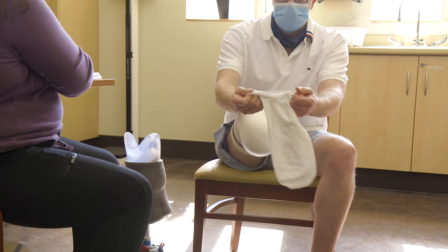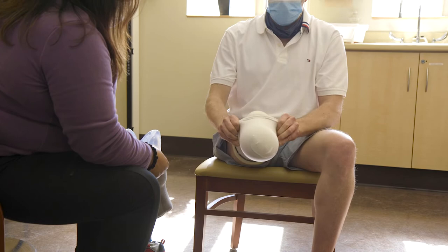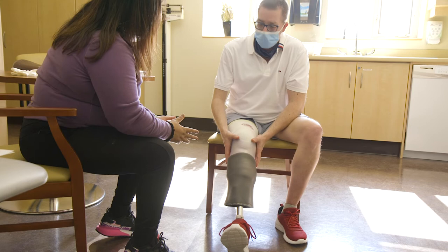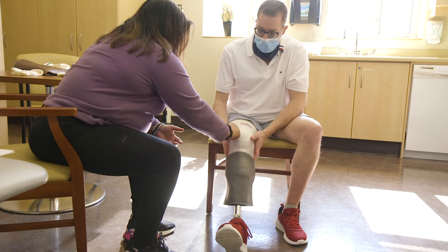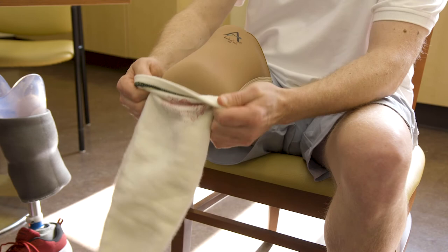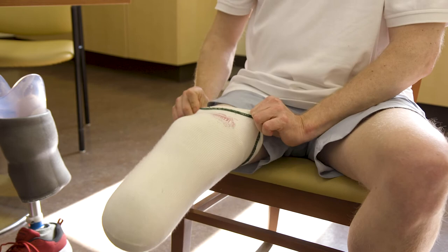If your prosthesis is too tight, you will not be able to fit your residual limb in all the way. You may feel like your prosthesis is higher or taller than your other leg. You may feel pain under your kneecap as the socket is making too much contact there. For example, if you wear a sock with a green line, five layers of thickness, you may find more comfort by changing to one sock with a yellow line, three layers of thickness, along with one beige one, one layer.